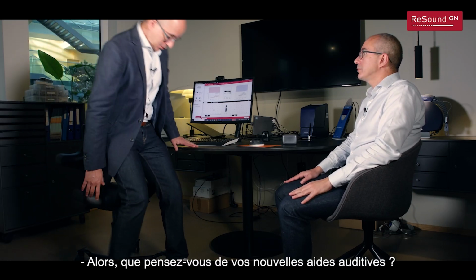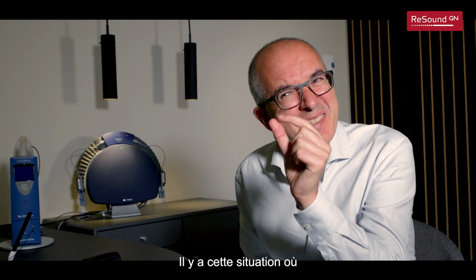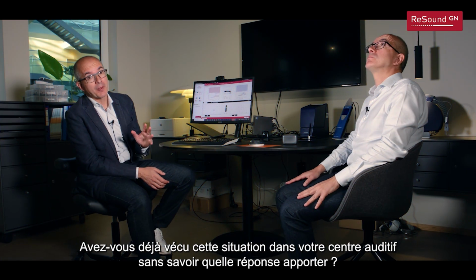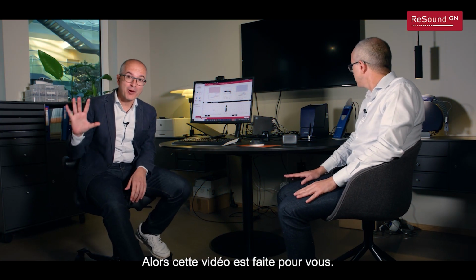So, how do you like your new hearing aids? Oh, I love them! But there is this one situation where I wish I could hear better. Have you ever experienced this situation in your clinic and don't know what to do? Then this video is for you.